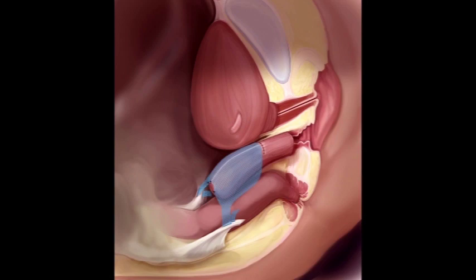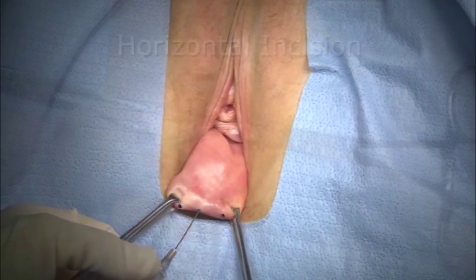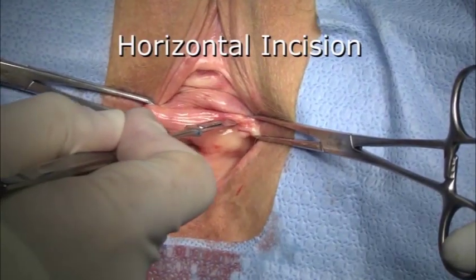The Uphold Light Vaginal Support System will be used. It is designed to achieve a level 1 mesh augmented repair through a single small anterior vaginal incision.